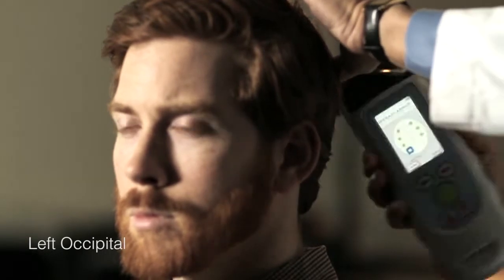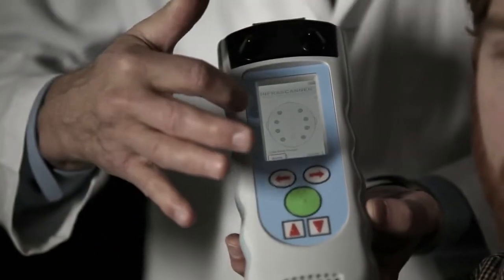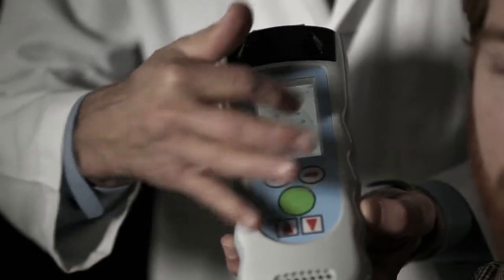We depress and again see the symmetrical reading. We complete the last measurement in the occipital area, selecting the line between the top of the ear and the back of the skull, midway between that spot. We again work through the hair at the same point between the top of the ear, the external protuberance of the skull, and midline. We now have an absolutely normal scan bilaterally in all eight areas, four on each side.